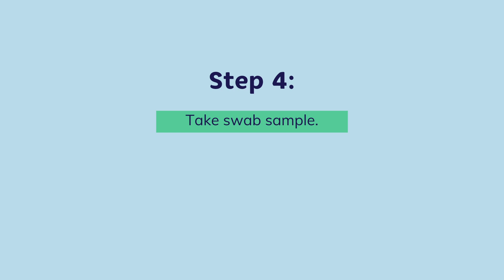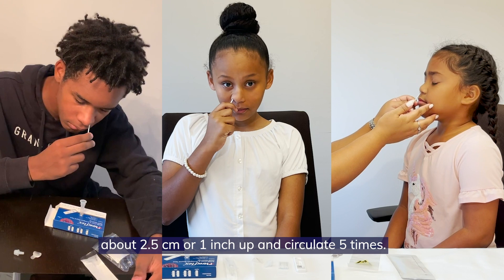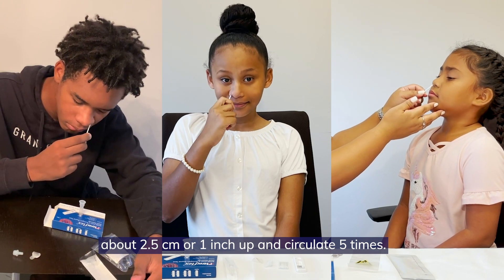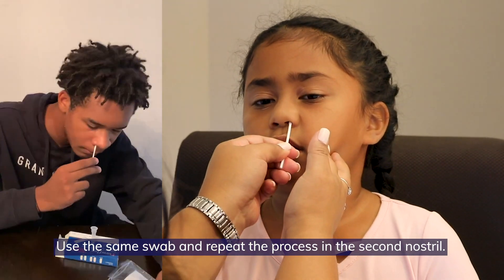Step 4. When you're ready, place the fabric tip of the swab inside your nostril, about 2.5 centimeters or 1 inch up, and circulate 5 times. Use the same swab and repeat the process in the second nostril.